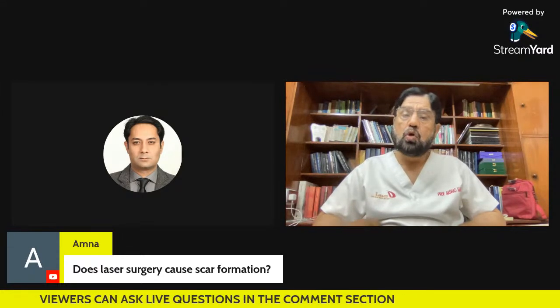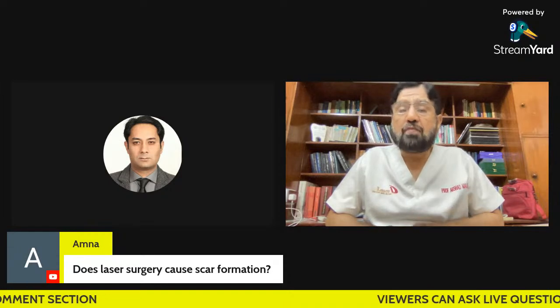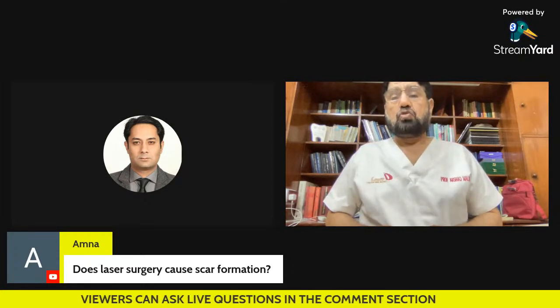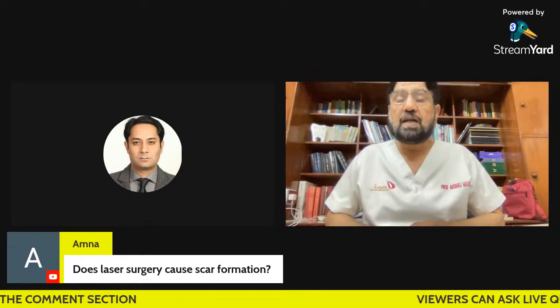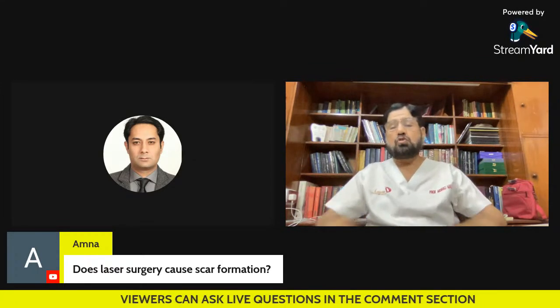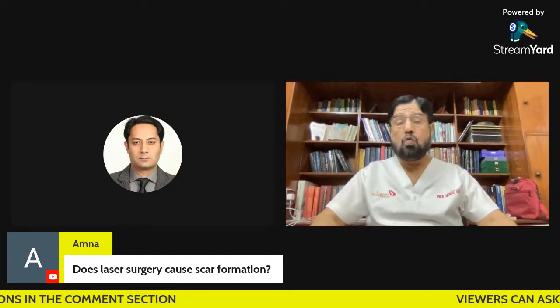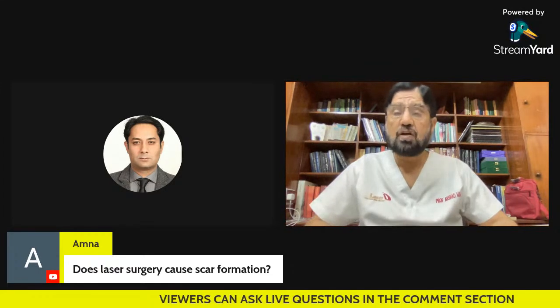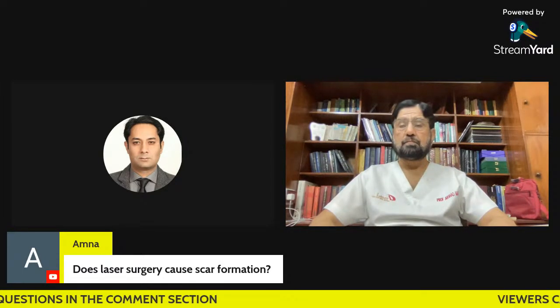drastic energy to activate the F3 fibroblasts. The F3 fibroblasts basically are more active and they form more collagen. So this is the beauty of the laser, that it activates F1 and F2, but it does not activate the F3 fibroblasts, which are scar forming and which actually make the ugly look of the wound. So it is another advantage of the laser, that we have less scar formation after laser surgery. Okay, right, sir.